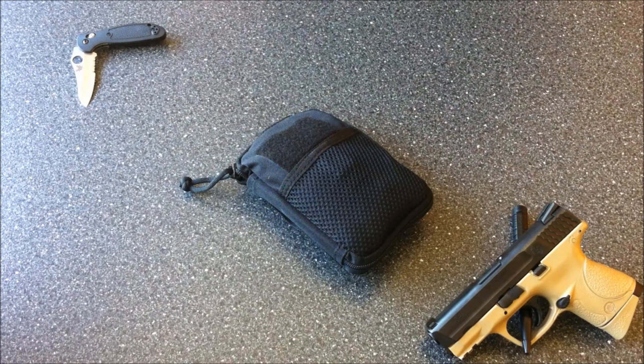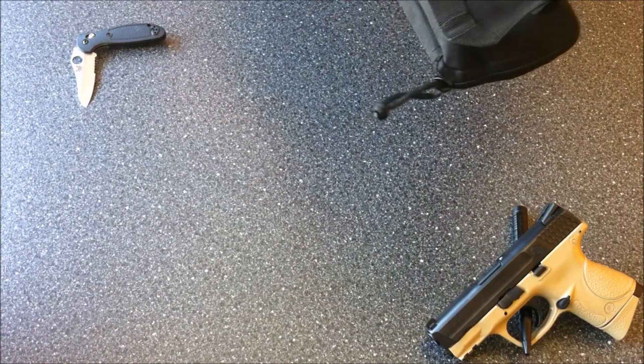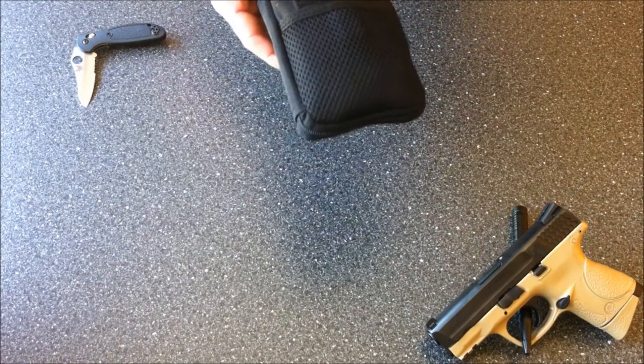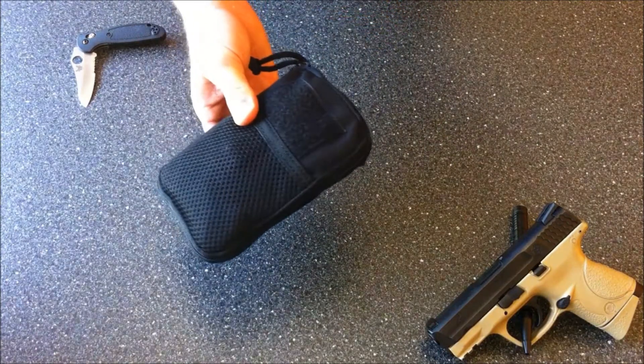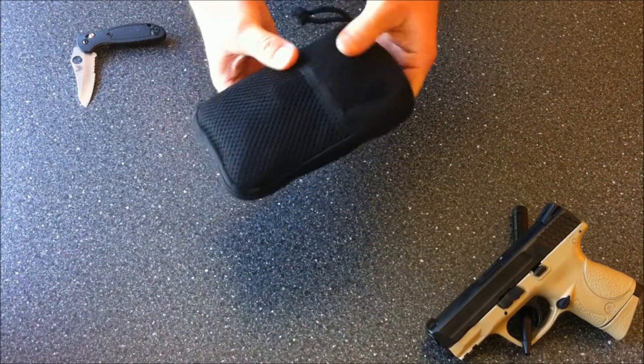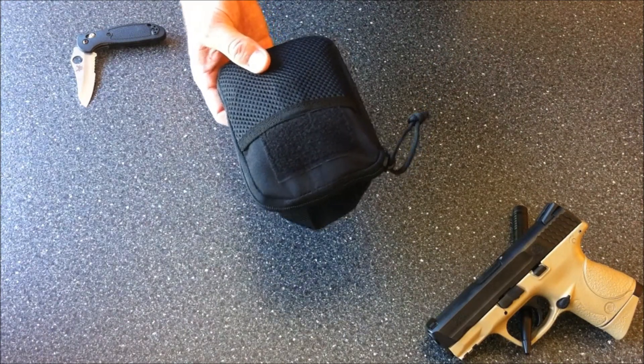I made this kit myself. I spent about $50 putting it together, and that includes the case. All the extra supplies I had I just put in my home trauma kit, so there's no waste. A lot of stuff you can get at your local drug store or online.